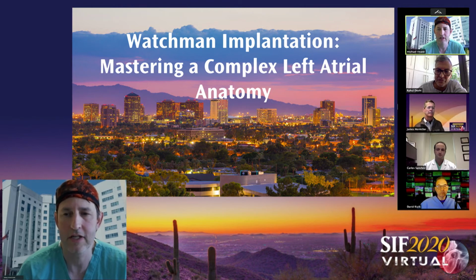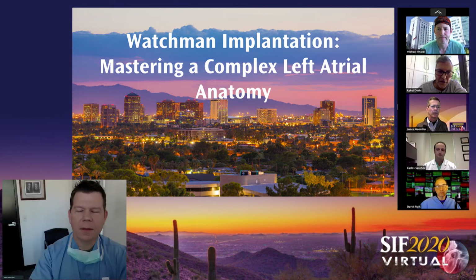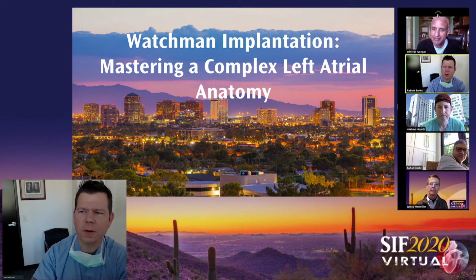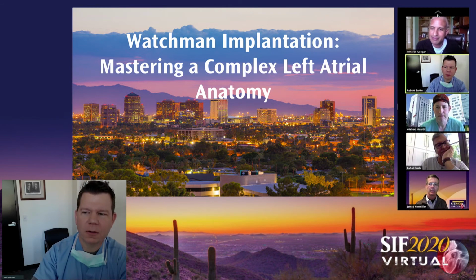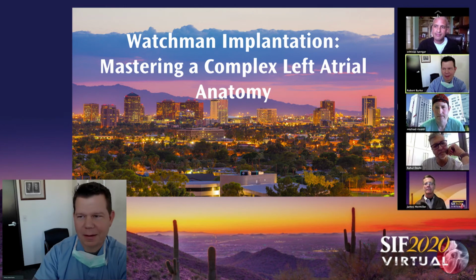It'll be very interesting to see if this debate about CT or TEE up front just goes away entirely and you just do them same day. Mike, I think we would still screen just from the standpoint of thrombus, just to make sure you don't have an issue in that regard. So I think we're probably not going to be able to get away with it entirely without looking. Even with therapeutic anticoagulation, we always get a case or two a year where there's a thrombus for reasons that really aren't anticipated, and then you find out that they haven't been taking their meds or something else.